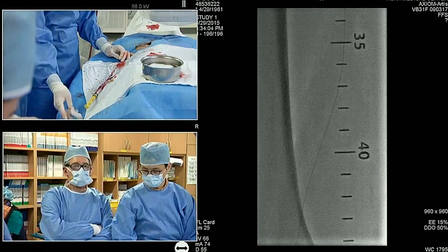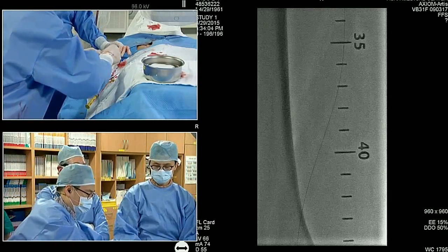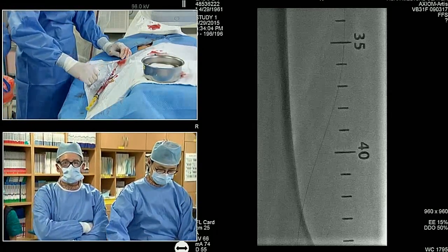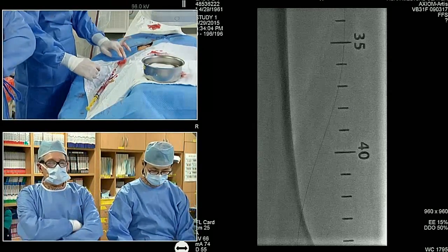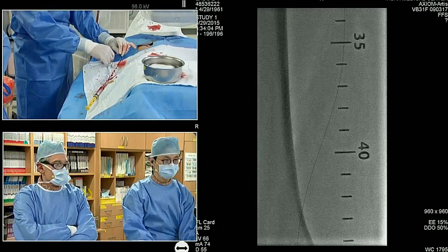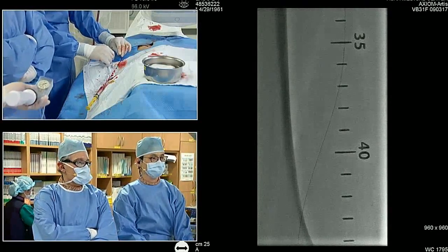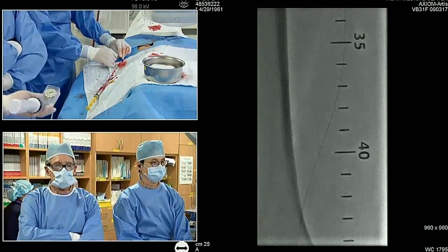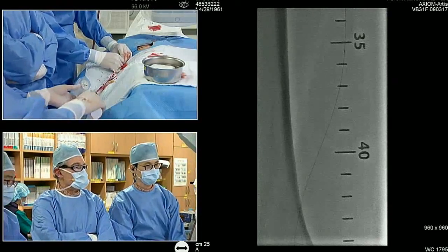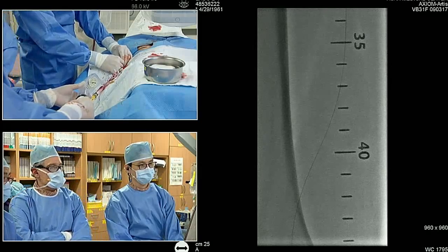Yeah, I went over it fairly quickly, but I think you saw in one of the fluoro playbacks that the wire was hung up there in the mid. I think that was at the area of calcification. So I just kept at it, and it found a way. The V18 wire is really quite good at navigating that, but I think you're right. I think there's a couple areas that are fairly hard, but on a relative scale compared to the other cases we've seen today, it's relatively modest. So I think we have all options, I would say.